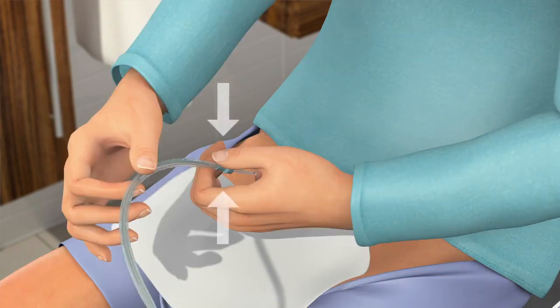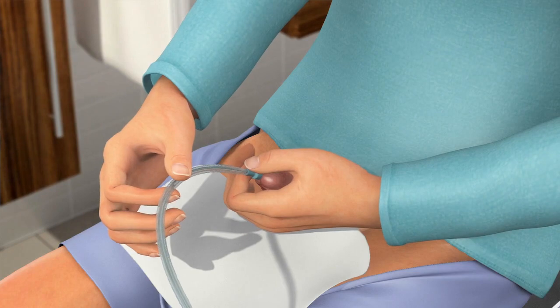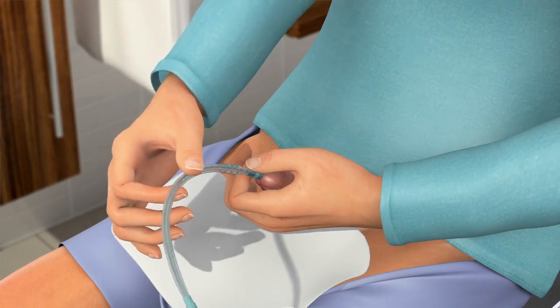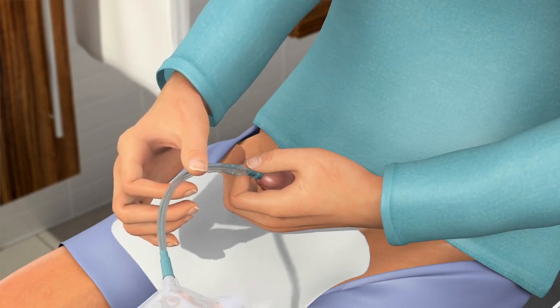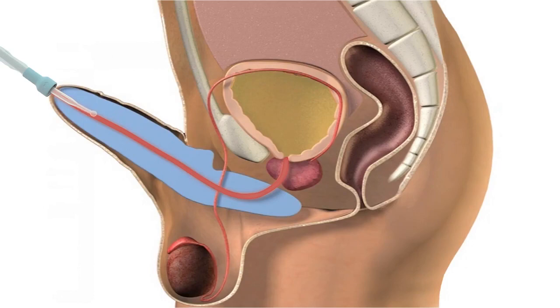To control insertion, softly squeeze the gripper indicated by the arrows. While supporting your penis, guide the tip of the catheter into the opening of the urethra. Once the tip is inside the urethra, make sure you hold your penis and the turquoise handle in the same hand. With your other hand, start inserting the catheter by pulling the sleeve towards the penis head. As the catheter is protected from contamination by the dry sleeve, you can take hold of the catheter at any point. Insertion is easiest if you take hold of the sleeve quite close to the penis head. Slowly and gently insert the catheter into your urethra.